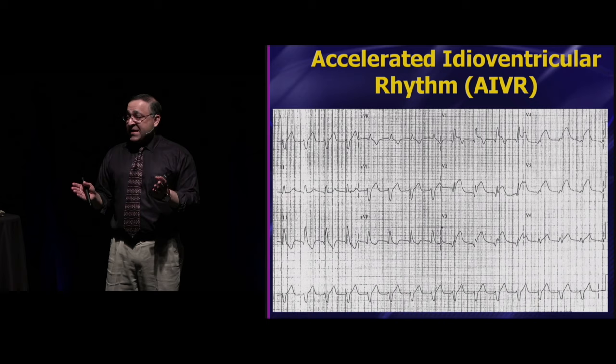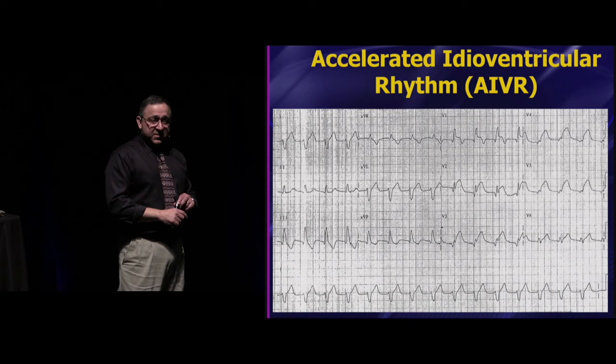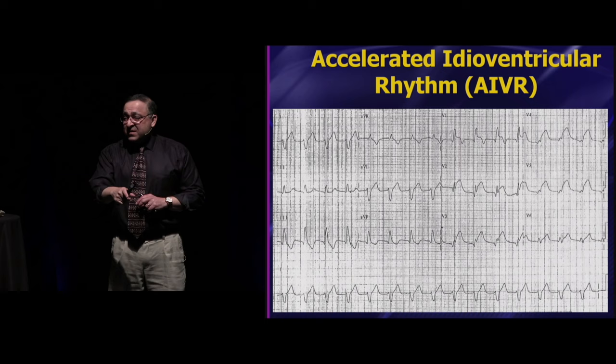So there's many, many cases like this that happen. It's common enough in history that you wouldn't be able to even publish a case like this. Most people don't want to run out and publish their mistakes anyway, but that's a different matter, all right? So what do you do when you see this? When you give the TPA, when you see this, I say you've got two choices.